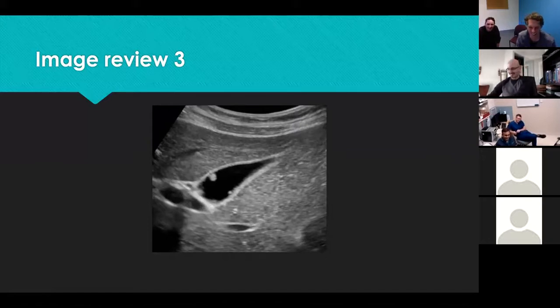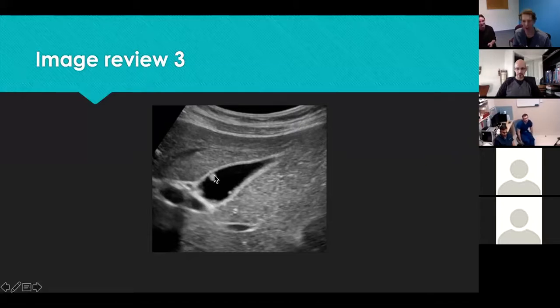That's fine. So again, this is a focused examination of the gallbladder, longitudinal view. It seems the gallbladder wall is thickened, and again, probably need to compare in different planes. There are two rounded hyperechoic structures inside the gallbladder cavity, one attached to the anterior wall, one attached to the posterior wall, but they both are not producing any posterior acoustic shadowing.